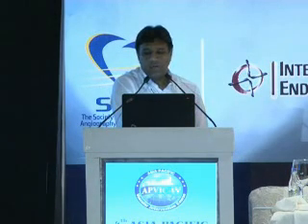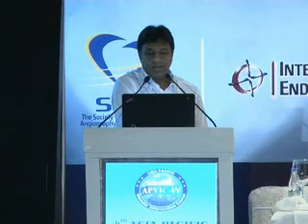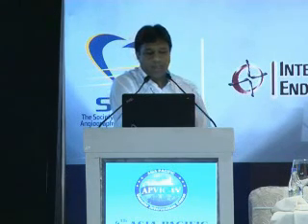The balloon size and length is matched to the size, 5 to 6 millimeter, and the lesion length is 40 to 300 millimeter. Improved angiographic results may be accomplished with prolonged inflation times, 3 to 5 minutes. Dissections are commonly seen after balloon dilatation due to heavy calcification.